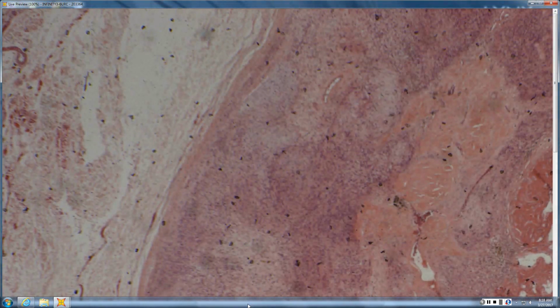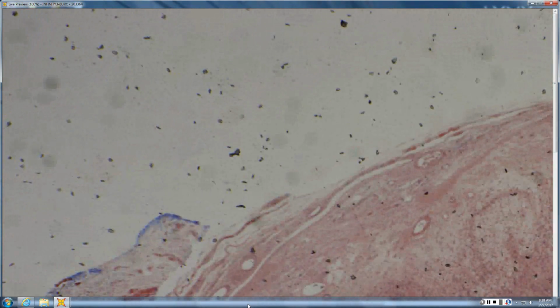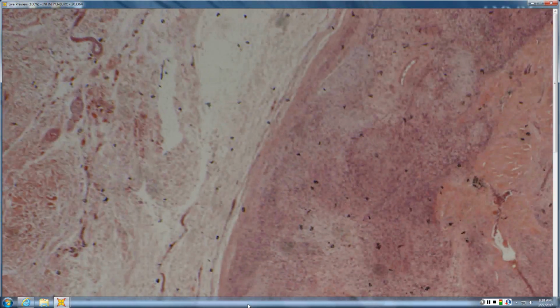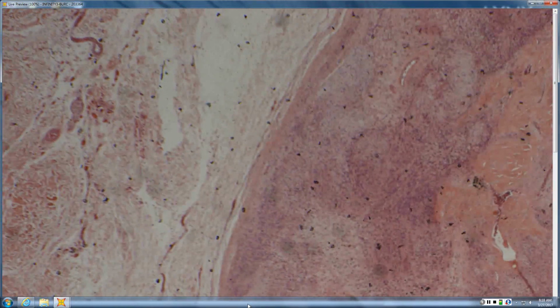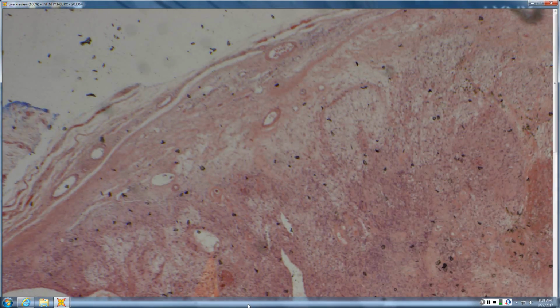So, first thing that stands out is it's pretty pink. Capsule yes, capsule no. Yes. Subcapsular edema, yes or no? Yes. So I see something that is encapsulated with subcapsular edema. What should be the first thing that I think of? Like a PEN? No. Schwannoma.